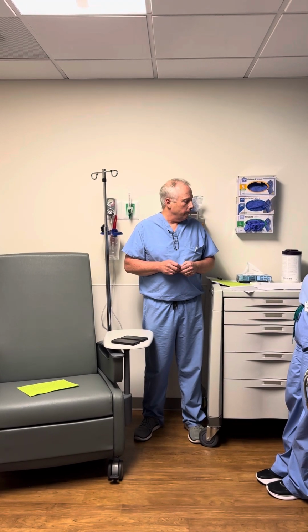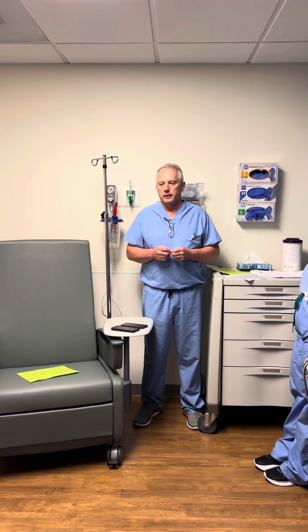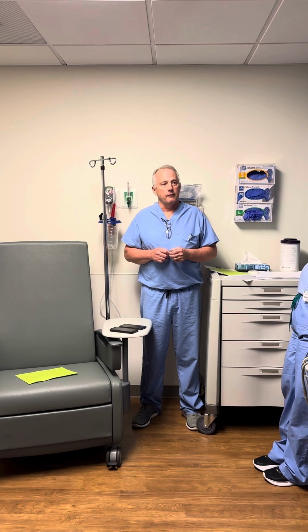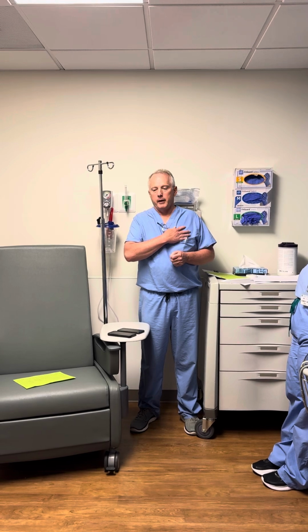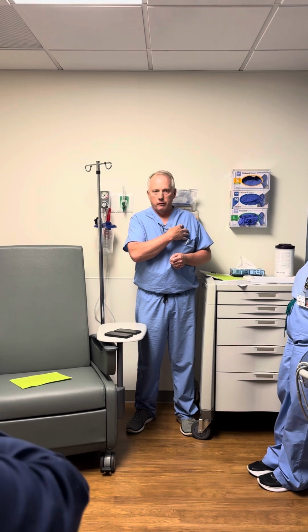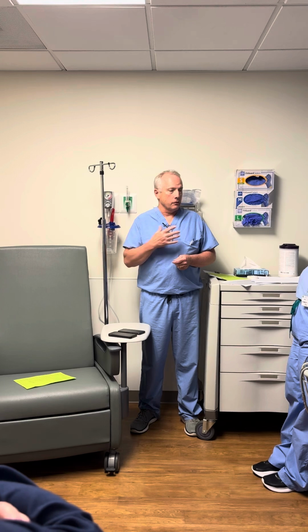As far as the defibrillators, again, it just disables the therapies. You pull it off, it'll go right back to enabling its therapies. And it's rare that we come in anymore to have these devices programmed. A lot of times if you're going to operate on the area where it is located, such as breast augmentation surgery or anything like that, they will move the device over. If it's that serious of a surgery, the electrophysiologist will move it over to the right side in another procedure before they even do the breast surgery.